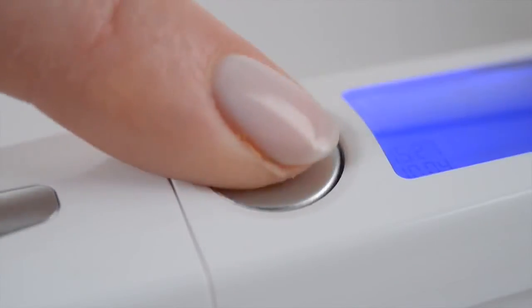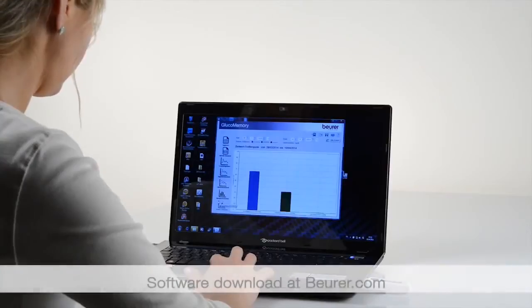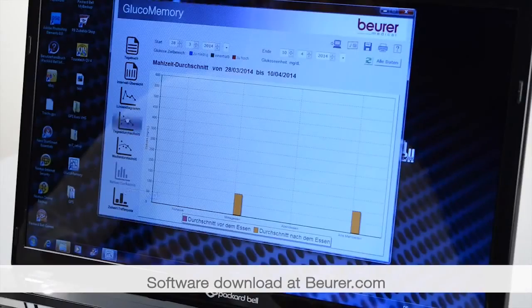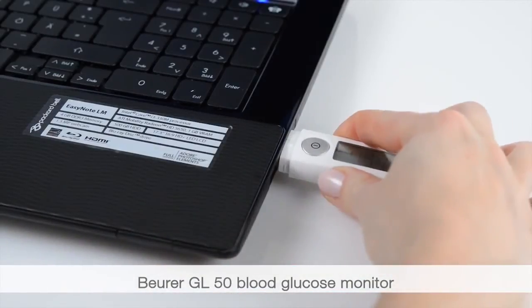Switch off the device. You can request individual values or average values. It is possible to perform software-based analysis using the Beurer GlucoMemory or the Health Manager. For this purpose, connect to the GL50 directly.